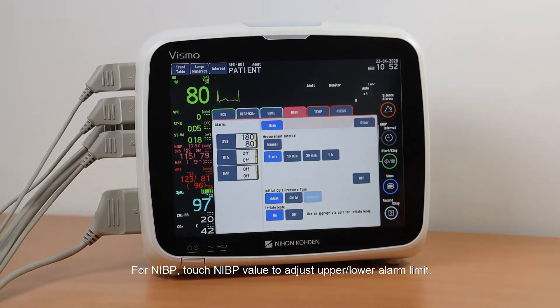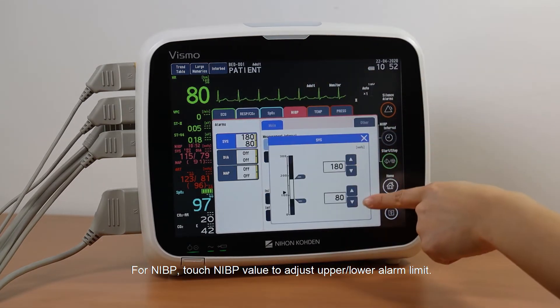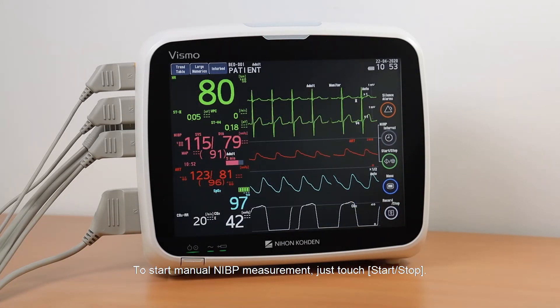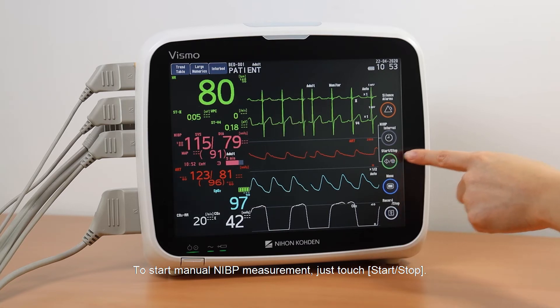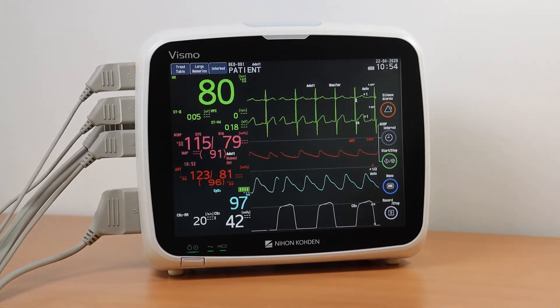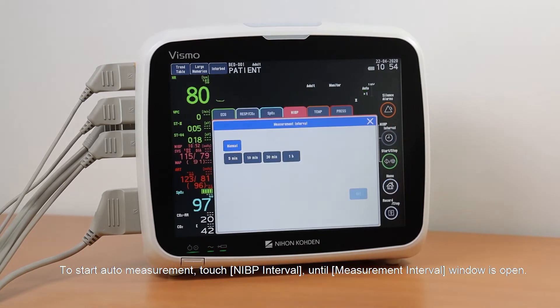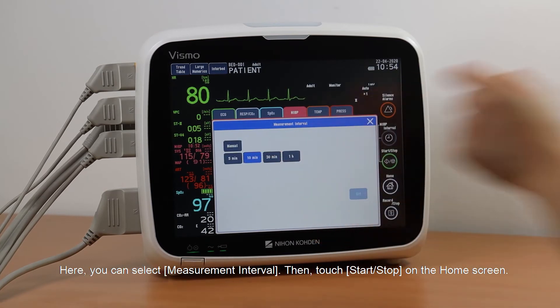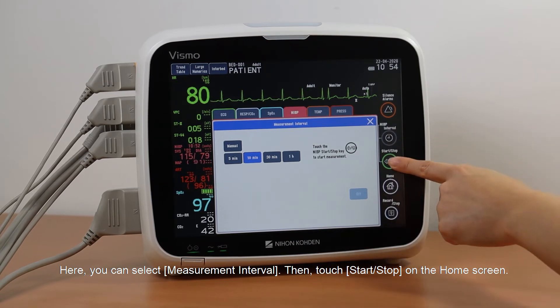For NIBP, touch the NIBP value to adjust the upper or lower alarm limit. To start manual NIBP measurement, just touch Start/Stop. To start auto measurement, touch NIBP Interval until the Measurement Interval window is open. Here you can select the measurement interval, then touch Start/Stop on the home screen.